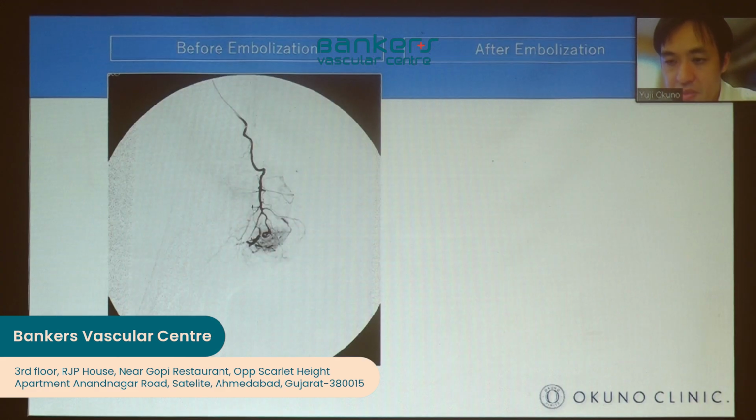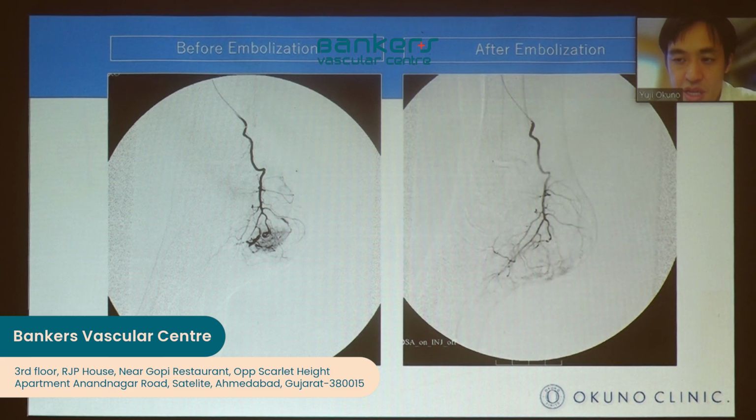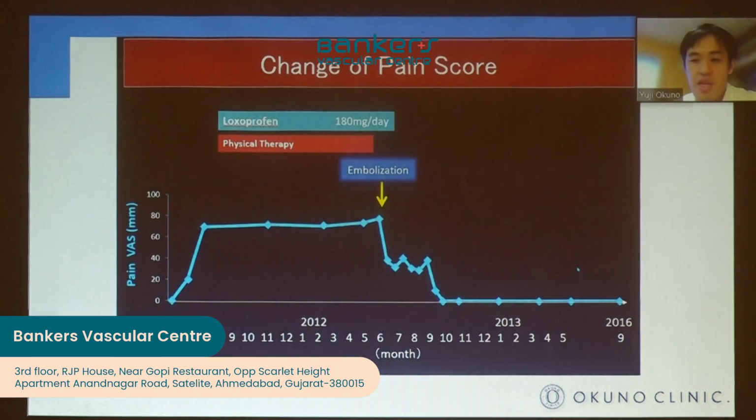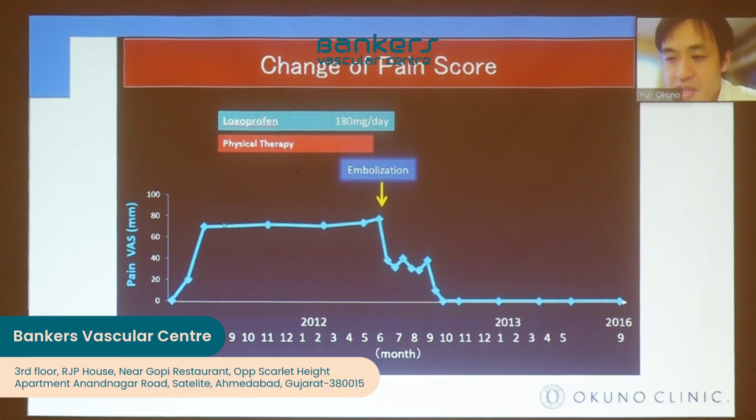This is the angiography, the left before embolization and the right after embolization. You can see the inflammatory neovessels disappear, and at the same time the normal blood flow increases. And this blue line shows the change of pain VAS score.